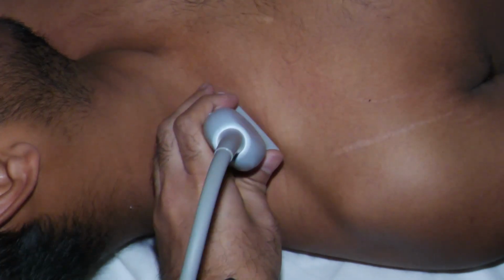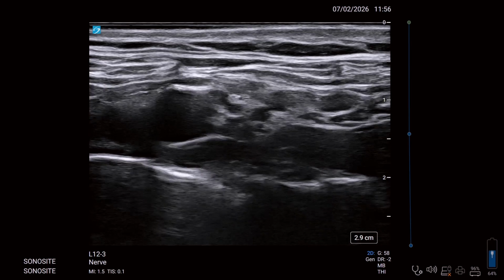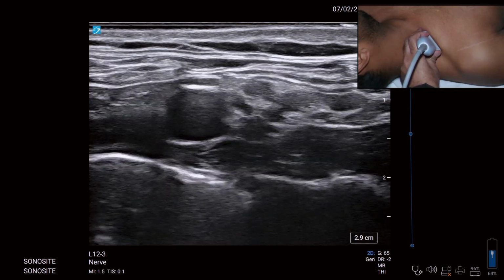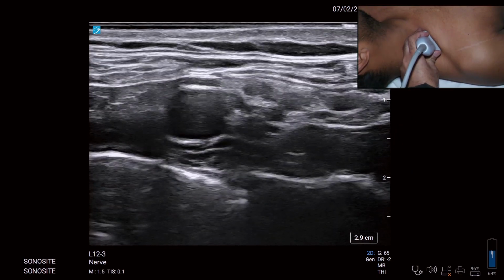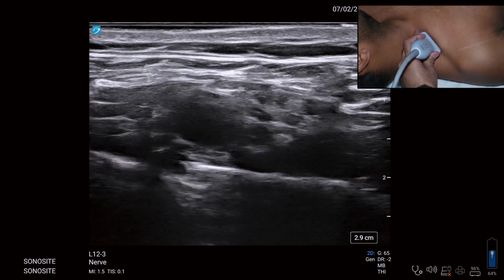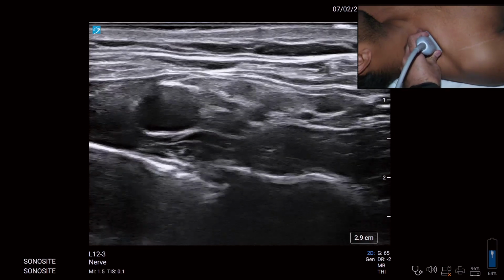So again scanning, starting from the ultrasound machine. So gain a little bit adjust, so that it comes up properly on the screen. Yes. So subclavian artery is sitting on the pleura. So what do I need to do? Into the thorax. This maneuver will help you. The entire plexus is situated like this. Can you appreciate? Okay. So I will keep going up.